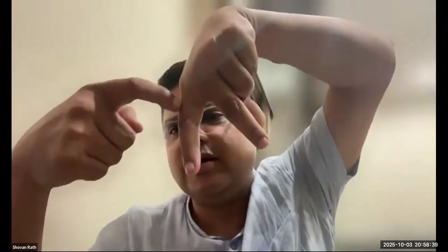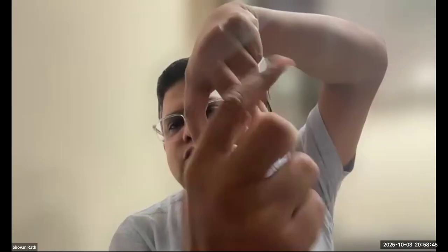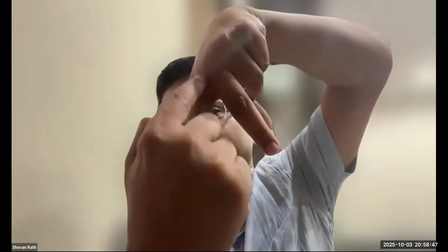It is like this: this one is the traversing root and this is the exiting root. So we are putting the drug over here at the axilla. It will go into the epidural space, come here, as well as come into the exiting root. That part you have to confirm by seeing the patient, the clinical examination, as well as the MRI. That will confirm it. Accordingly, you will be changing the position of the needle or the drugs.